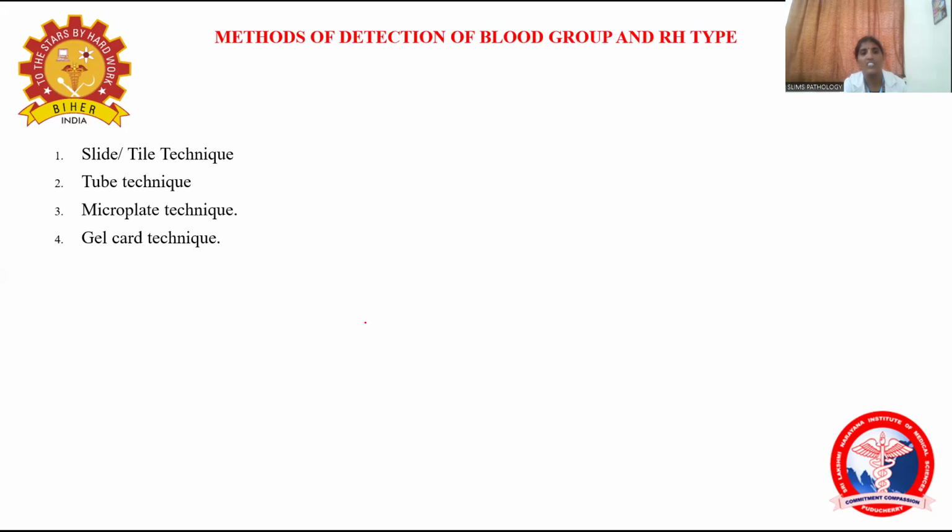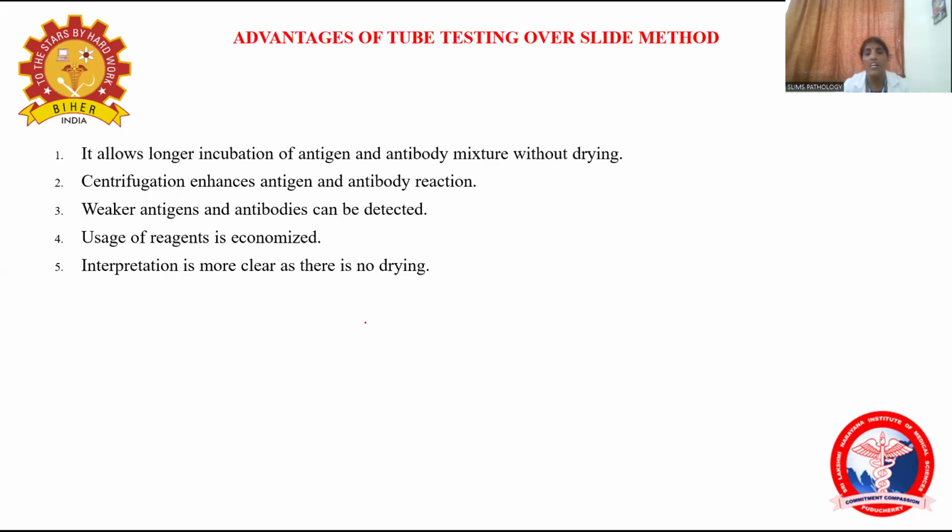The choice among them is based on the resource setting. I said gel card is one of the currently available technologies that most medical colleges tend to use. But in resource limited settings, the first two are the most common. Number one is slide followed by tube. Comparing slide and tube, which is more advantageous is the tube, I would say. What are the reasons for tube to get a higher vote? What are the advantages of tube testing over the slide method?